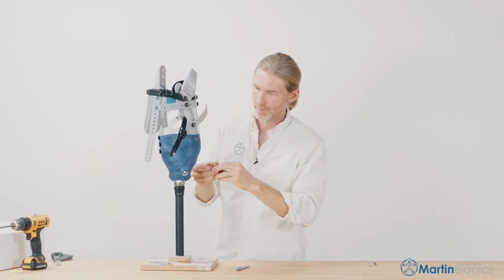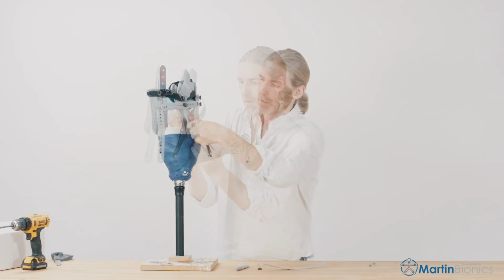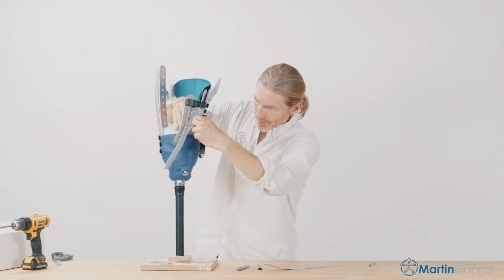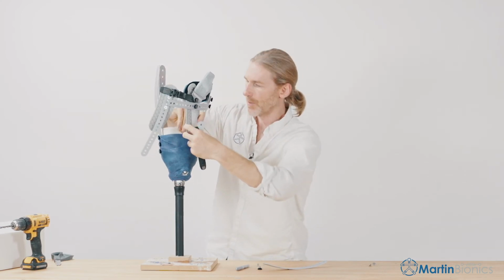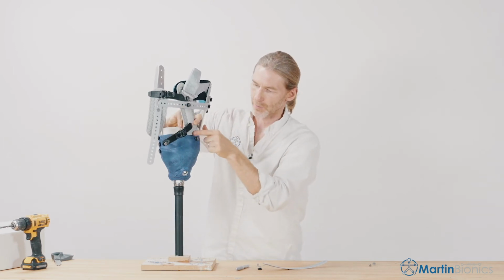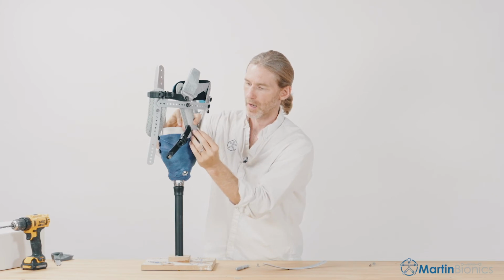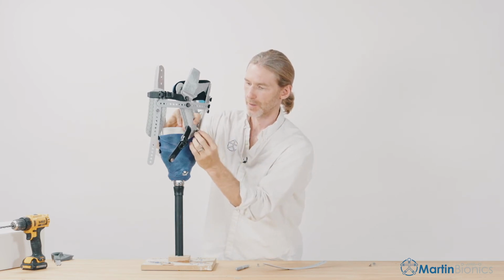All right, pop my thumb screws back in place. Now for long limbs, you can have a second ratchet. For short limbs, you typically don't need it. I'm going to move this bottom band of cross connectors and the bottom ratchet. I like these to be kind of right in the bottom hole. It could be the second hole up as well. Either is fine, either here or here. I like to fit them here typically though.